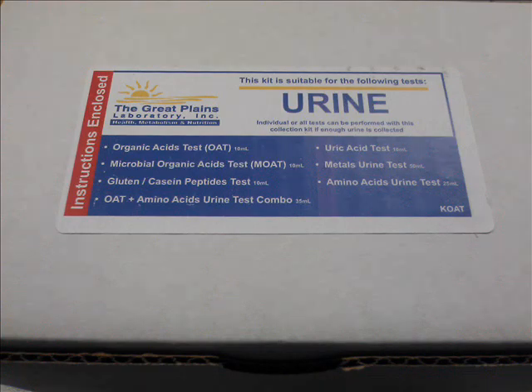First, let's review the contents of the test kit. All materials that you will need will be contained in this small box. The label shows which tests can be performed with this kit. As you can see, we can perform the organic acid test, microbial organic acid test, gluten casein peptide test, uric acid test, metals urine test, and amino acid test with a sample from this kit.